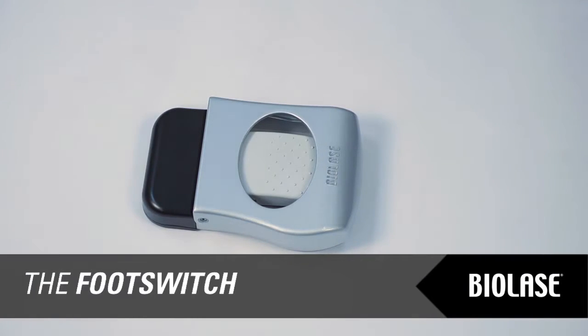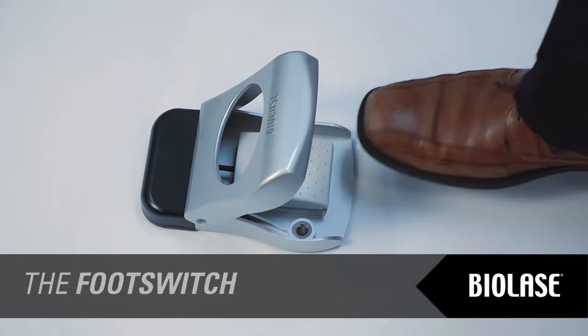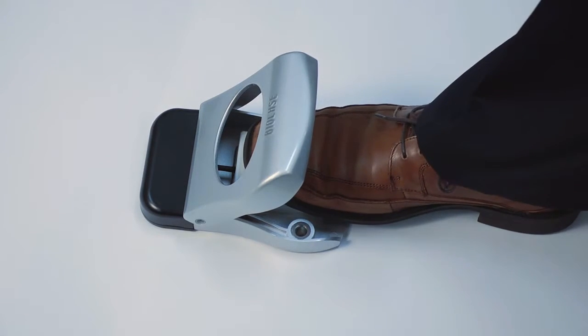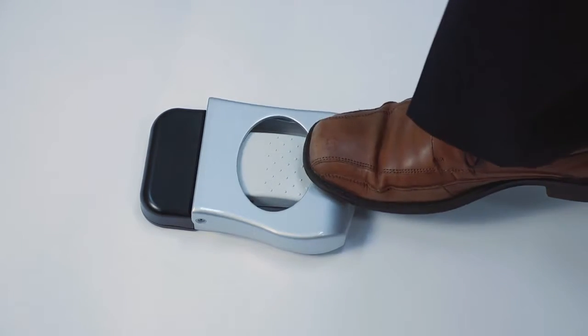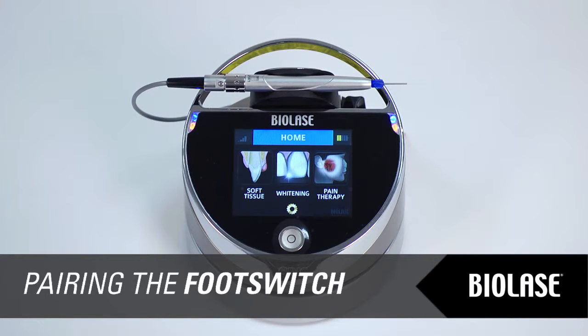Finally, you will see a settings icon to access the settings screen. The foot switch used to control EPIC wirelessly has a protective hood. To open the foot switch, press down on the protective hood and it will raise. To close it after use, simply press on the protective hood until it locks. Your EPIC and foot switch are paired at the factory.